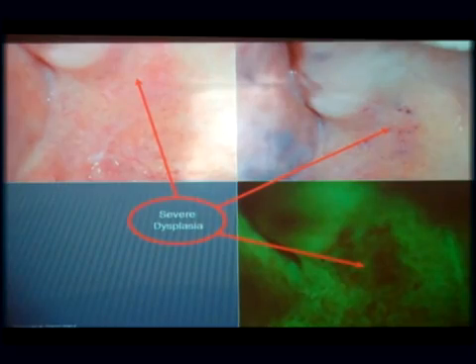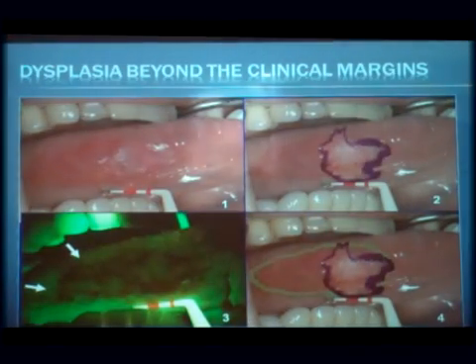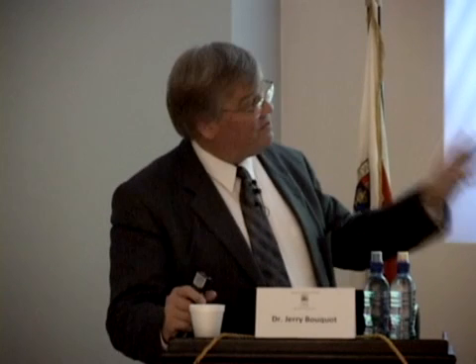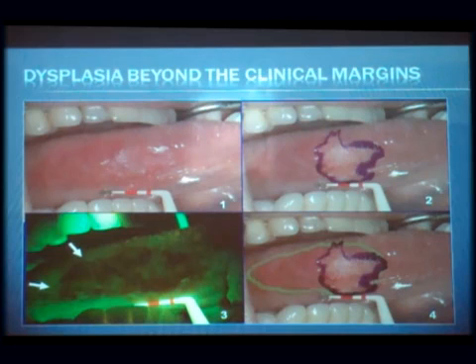And, well, we won't get into this. Toluidine blue does the same thing. This is what it's approved for. It's approved for 2 things by our FDA, which is, as I mentioned, under the gun from its citizens. They wanted to do a better job with devices, not so much the medicines, but devices. And so they have approved this for identifying lesions of dysplasia. It's actually approved for finding those.